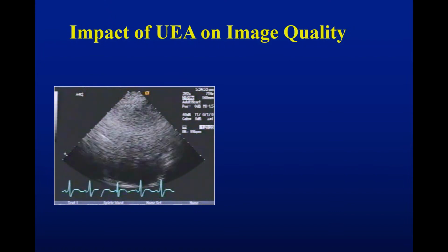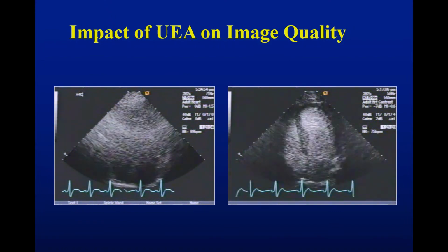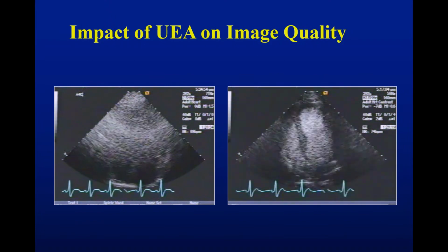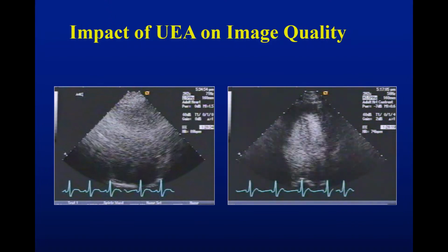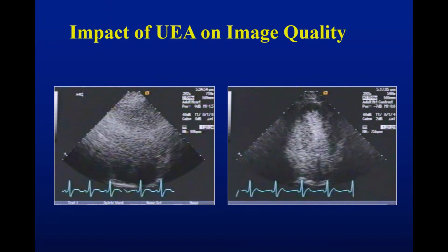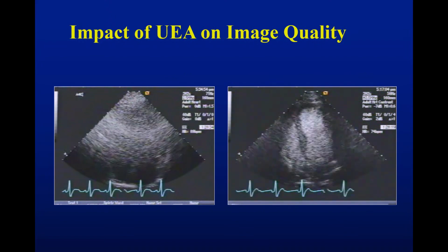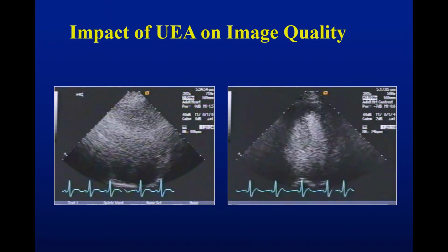Now the power of ultrasound enhancing agents is really amazing. Just take a look at this example. Usually you don't like to show such studies, but take a look at this example. This is from our early experience. You could see that all of a sudden the light shines on your heart, and you could see the cavity very nicely to evaluate its size, its function, regional as well as global. So the powerful impact of such modality is crucial.